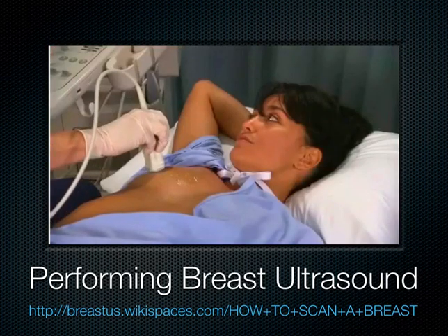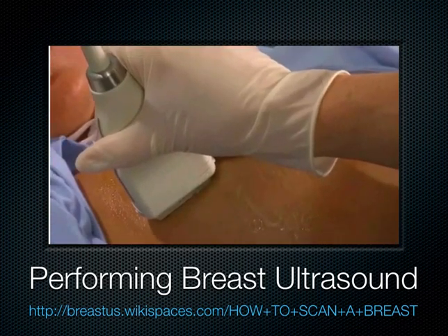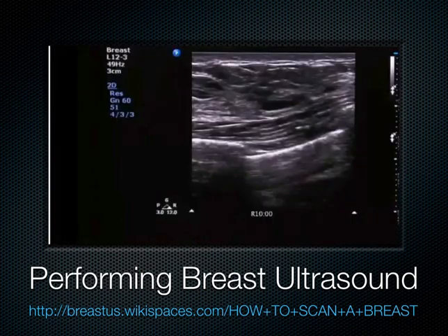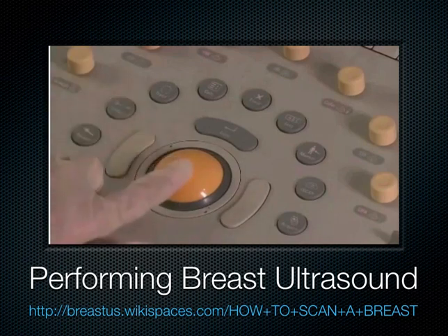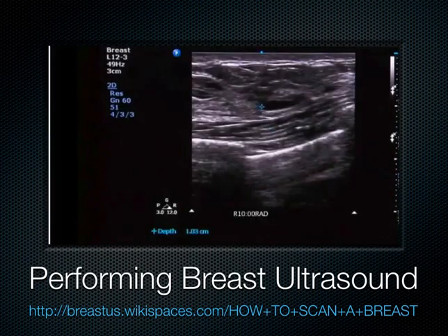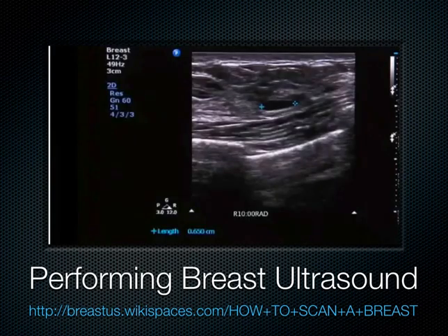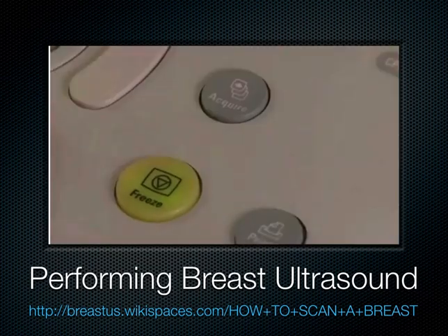If a lesion is encountered, manipulate the transducer and optimize the image. Freeze and annotate according to the protocol. Measure the length of the lesion by placing 2 calipers on the superior and inferior margins of the mass. Measure the height of the lesion by placing 2 calipers on the anterior and posterior margins of the mass.